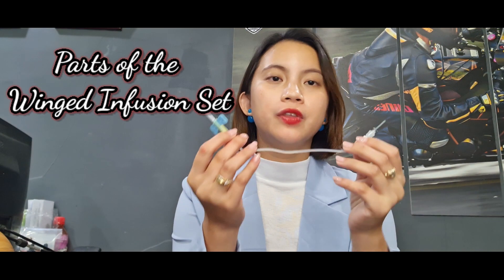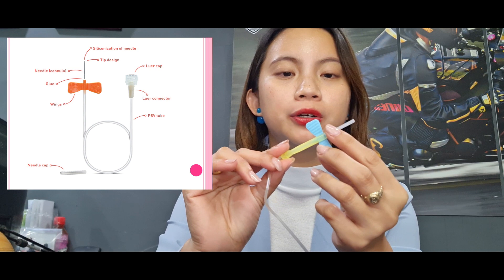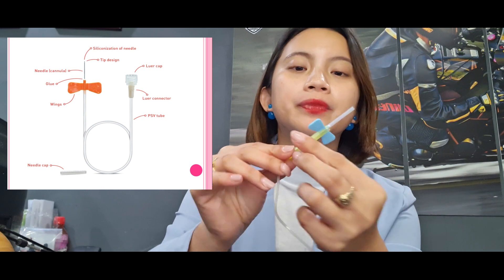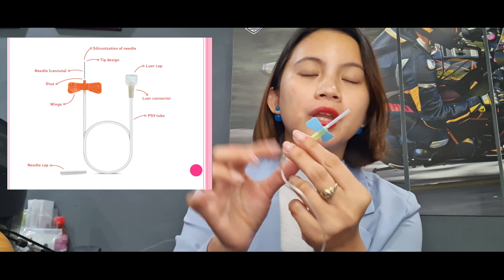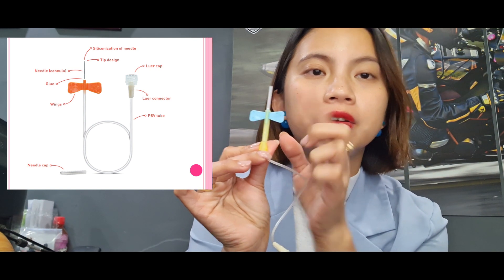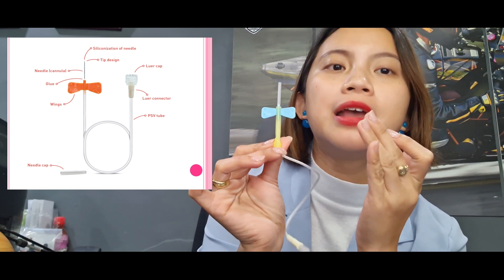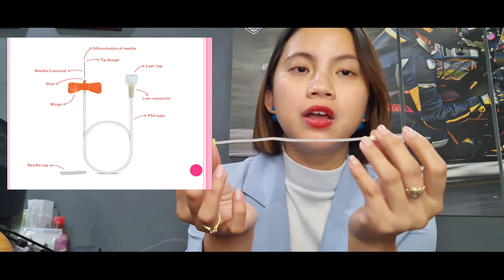So for today, I will be teaching you the different parts of the winged infusion set. This one here is the needle cap, under which is the siliconized, ultra-sharp, three-beveled cannula supported by the large interlocking wings. This one over here serves as the hub. So when you insert the needle on the arm of the patient, there will be blood seen over here, which indicates that you have entered the correct vein.